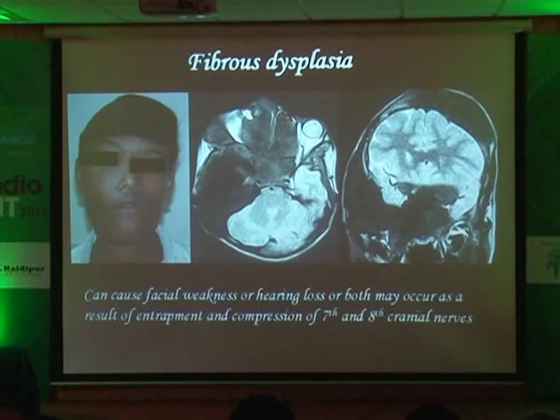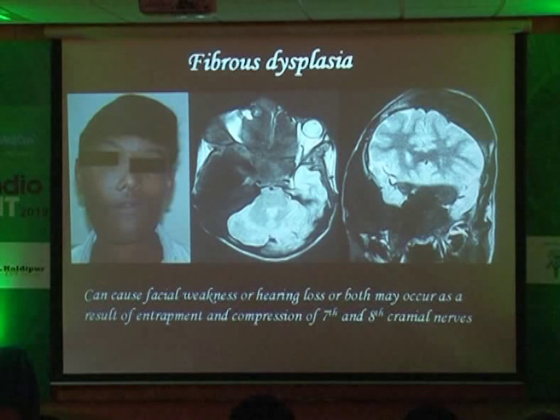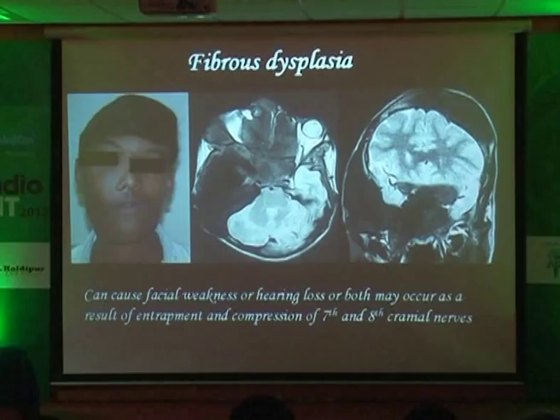Small take-home message: one — ice cream cone appearance means epitympanum. Two dots, two lines — mesotympanum. Nothing — hypotympanum. Next: look beyond the temporal bones, especially in cases of fibrous dysplasia.